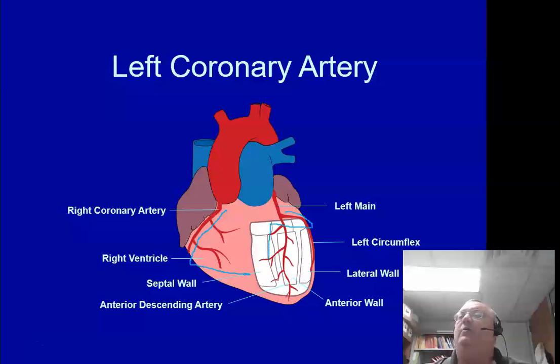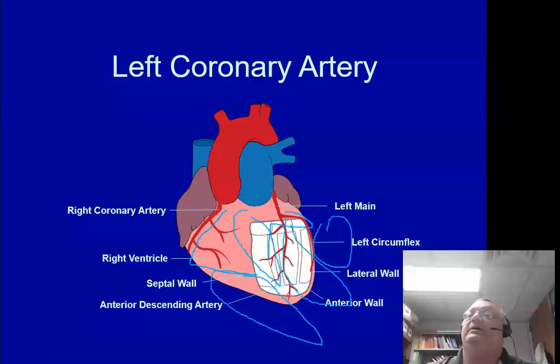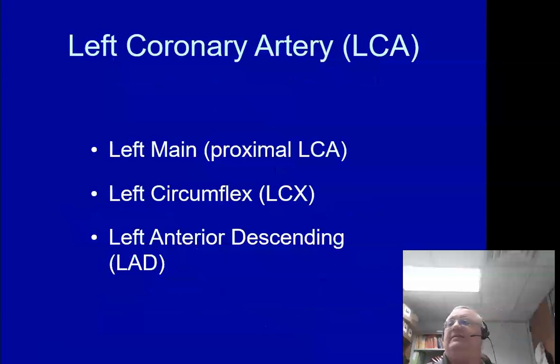So again, one of the things that, by the way, I want to stress, and we're getting to that point where I get to talk about my lovely 15 lead, is that, guys, a standard 12 lead looks at this area, the lateral wall, and this area down here. It does not really look at the right wall, and it doesn't look at the back wall, okay? Which is why when we do a 15 lead, that's going to make a whole lot more sense, because now we're going to get a total picture of the heart.